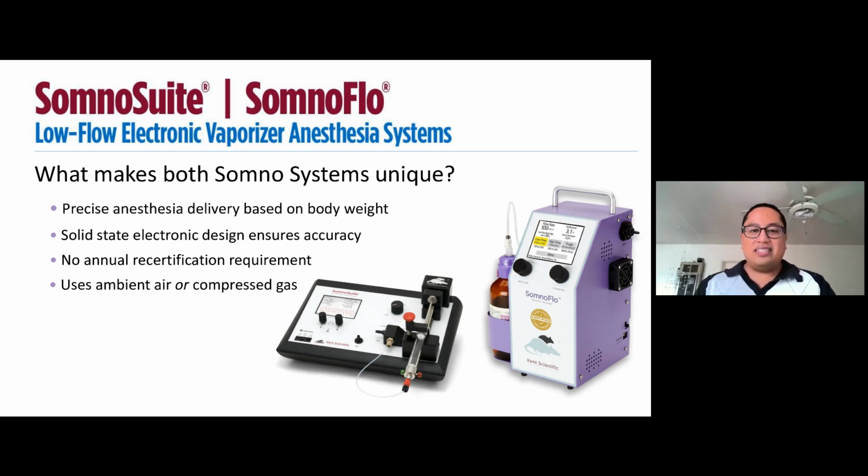Another benefit of these systems is that they allow you to use either compressed gas or ambient air as your carrier gas. This is a great feature to have, especially if your procedures do not require oxygen. You might lack the space needed for gas tanks, or you get tired of people stealing your gas tanks and leaving them empty on you, which has happened to me many times.